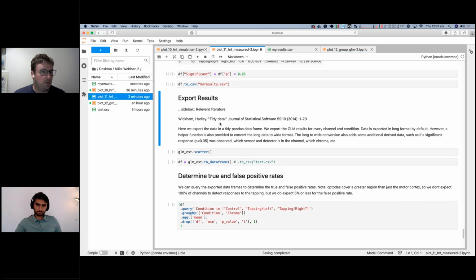I think that's where I'll stop the individual level analysis. Unless I've missed anything, Mayapol, is there anything that springs to mind? We do have a couple of questions that we may take. Perfect. Seems relevant to this part.